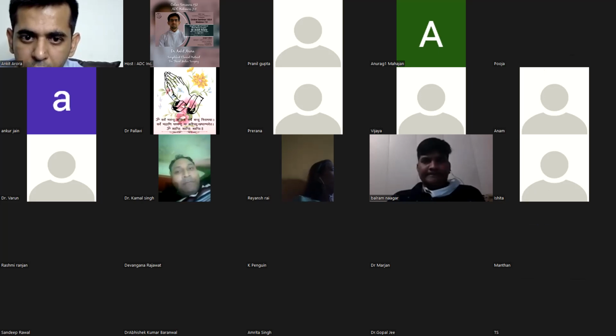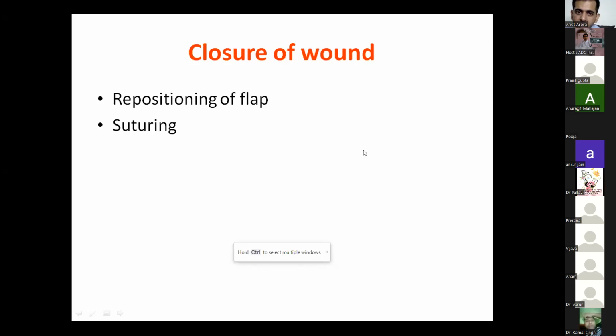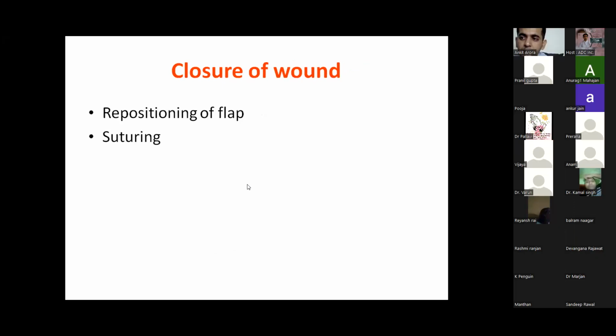Okay. Now what we have done is we have removed the tooth, and now we are at the closure of the wound. Okay, closure of the wound.